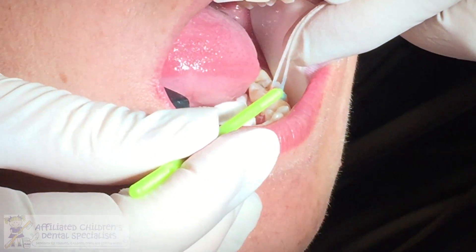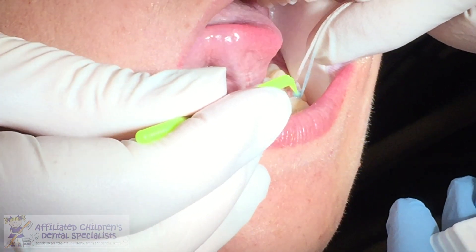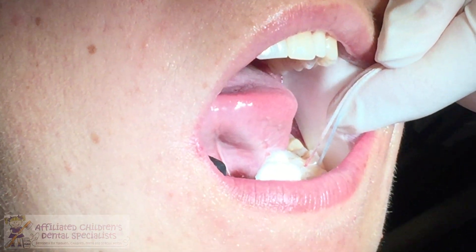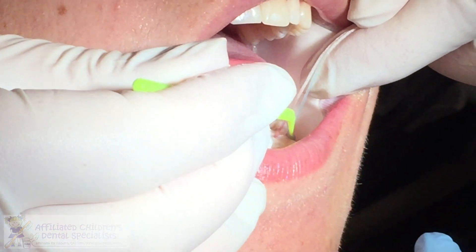I'm going to apply it on the buccal and on the lingual, and then you can go up over the marginal ridge. You can see it start to soak up — look at how far it went. See how I have my finger in front of his lip? Because if you didn't, you could stain his lips by accident. So you've got to be really careful where you're putting it.